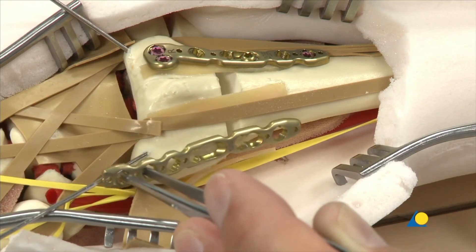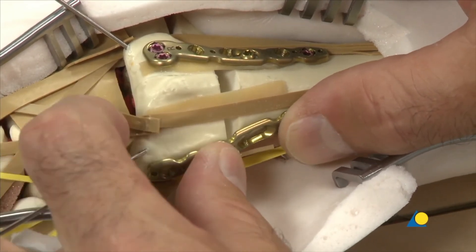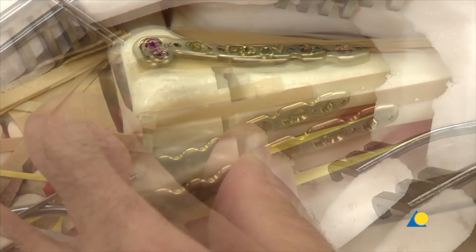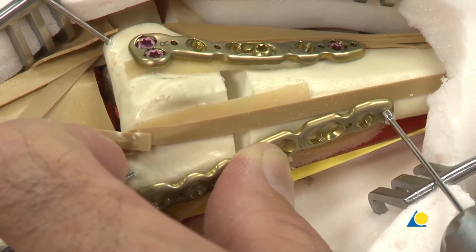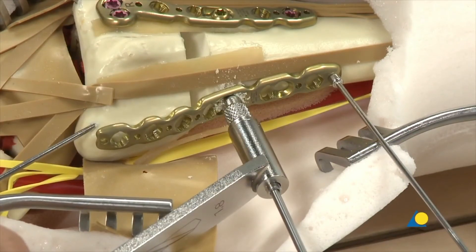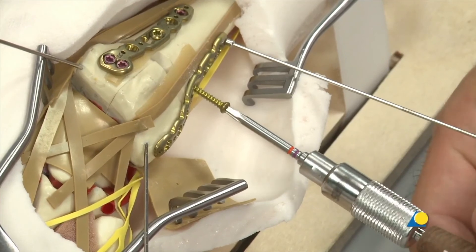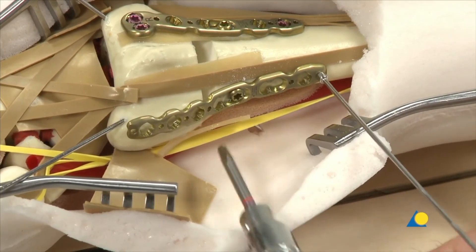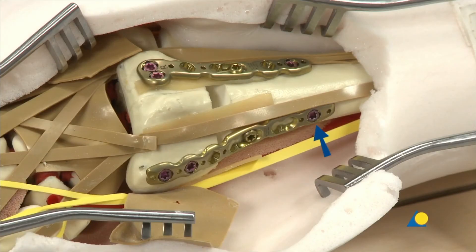The radial column plate is now applied and its position is adjusted. The 1.25mm plate reduction wire with small stop is used to hold the plate in position on the bone. After preparing a neutral hole, a 2.4mm cortex screw is inserted through the oblong combi hole of the plate using standard technique. The plate reduction wire is removed, and placement of the plate is checked under image intensification before continuing. A locking screw is inserted through the most proximal plate hole using the nominal angle technique, and two locking screws are added at the distal end of the plate using the variable angle technique.